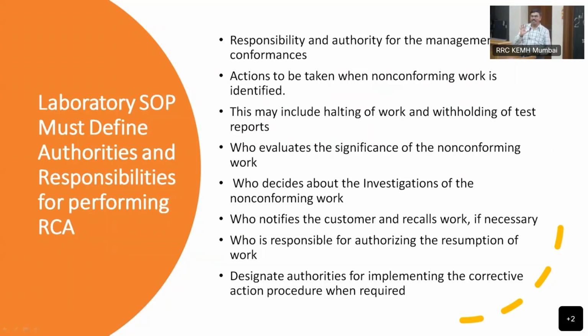Random error is diagnosis out of idiopathic. मालूम है ना idiopathic मतलब क्या? सारे diagnosis खत्म हो गए. Unknown reason है. उससे बोलते idiopathic. रैंडम एरर मतलब जब एरर मिला ही नहीं, कुछ भी एरर नहीं मिला, उसे बोलते हैं रैंडम. रैंडम इज द कॉम्प्लेक्स एरर.